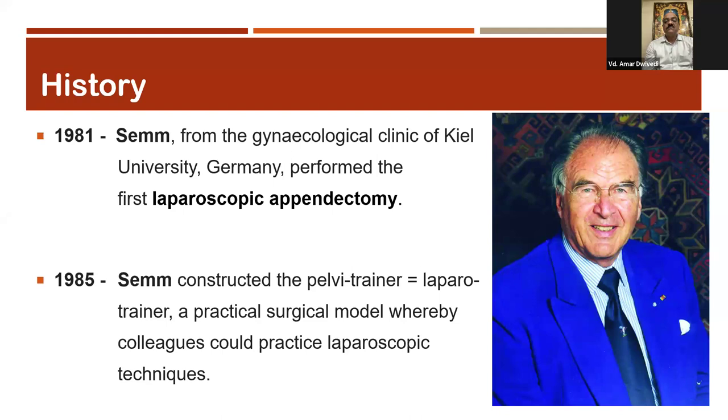So this is a very initial step for training purposes. There is a big difference between open and laparoscopic surgery. In open surgery, whatever we do, we touch the tissue and assess the tissue by hand. But in laparoscopic surgery, there is no touch sensation; we feel only with the help of the instrument. And there is one big difference: you see in one place and perform your function in a different place. So eye and hand coordination is needed for performing laparoscopic surgery.